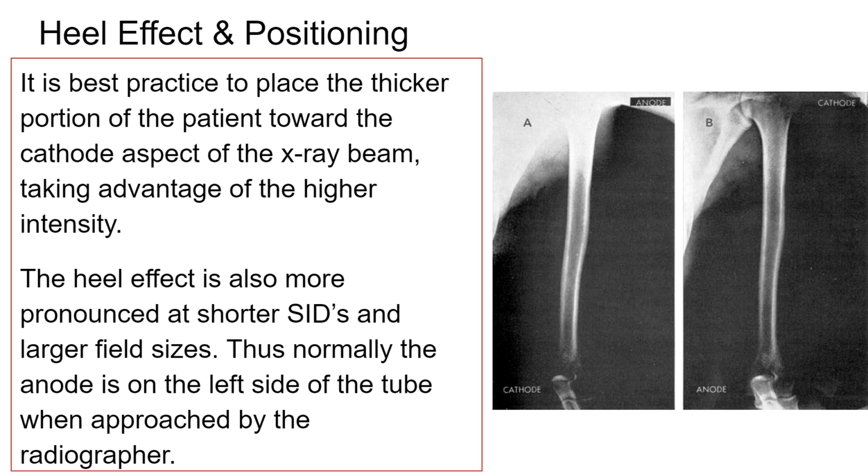Because you can't really show it on an image anymore. We can try, right? But much less heel effect. And room 1 almost has no heel effect, right? Even when you use a dosimeter. In other words, the difference between the radiation is very small.